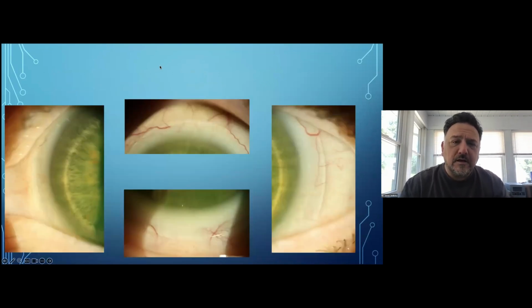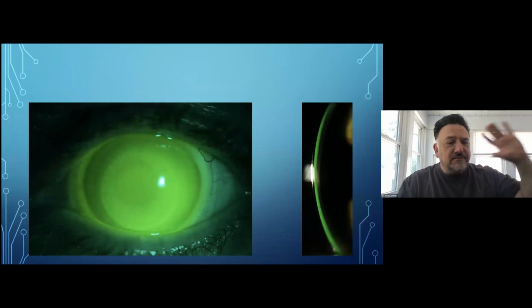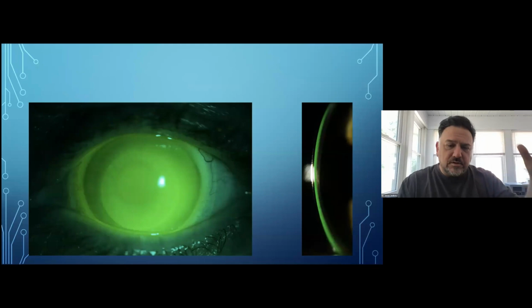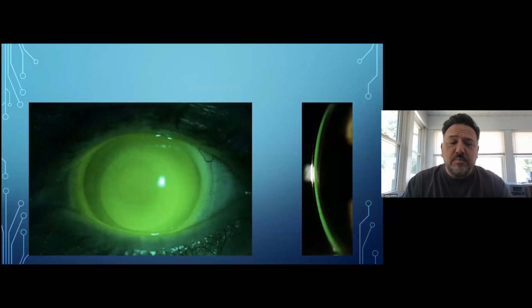All right. Oops, sorry, back up. And this is just a picture. These are just simply pictures of instrument aided, driven, first time out of the box, order the lens based off the topography, put it on. You can see by the picture on the left, this is a really nice fit. You can see the picture on the right, the vault looks about right, nice and even, 300, 350 microns, whatever. A very nice capability of creating lenses based upon the maps.